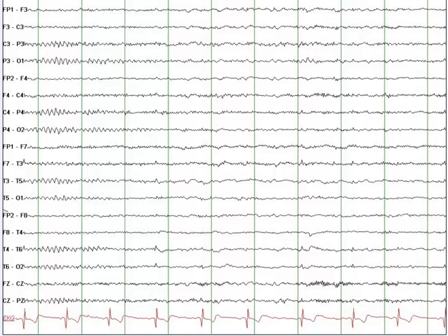This EEG transitions into stage 1 sleep. You are looking at a bipolar montage — Fp1, F3 — which compares the potential difference between the Fp1 electrode and F3.